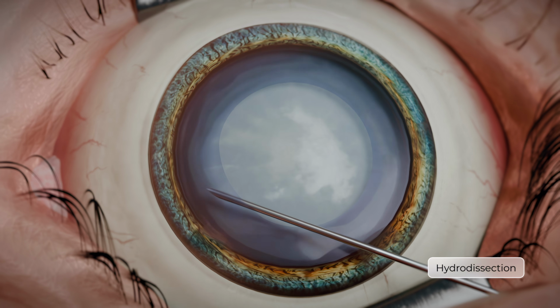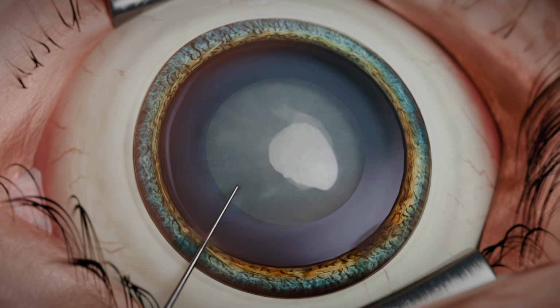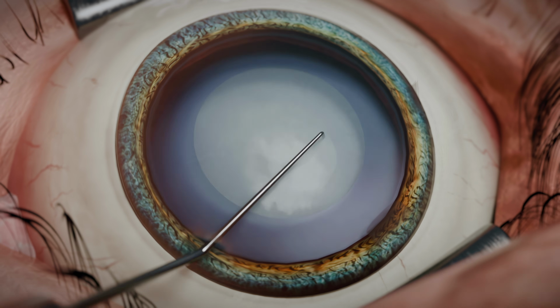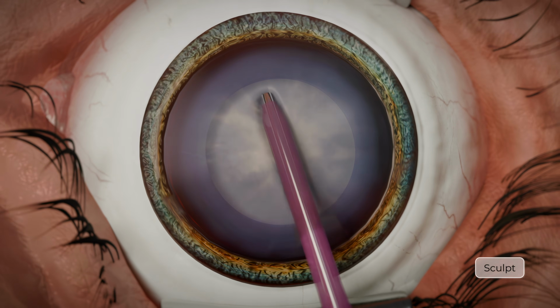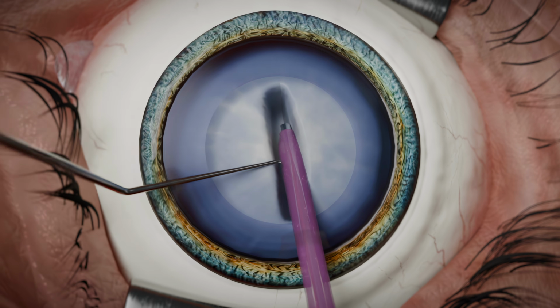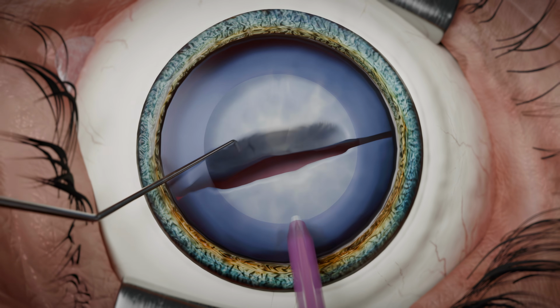Using a handpiece, an ultrasonic tip is inserted through the corneal tunnel incision into the anterior chamber for phacoemulsification. Through a paracentesis, a chopper, an instrument used to split the nucleus, is introduced into the anterior chamber. Phacofragmentation of the lens is carried out endocapsularly using the groove technique.